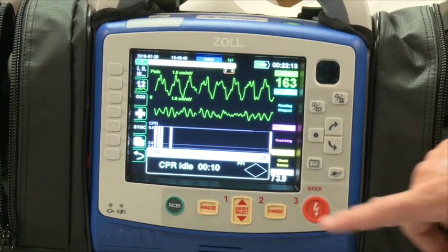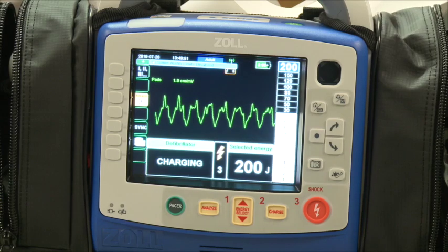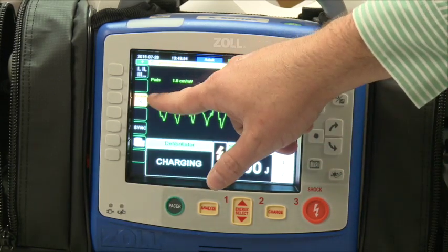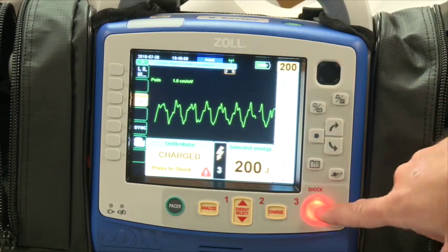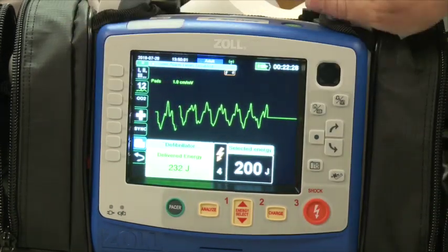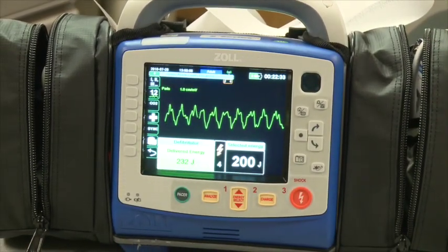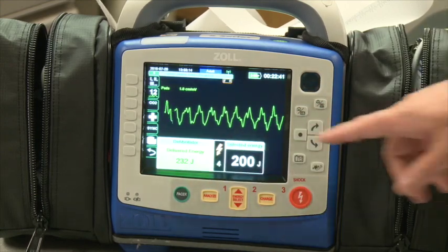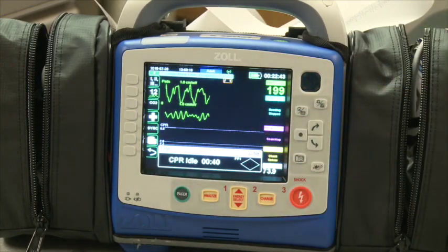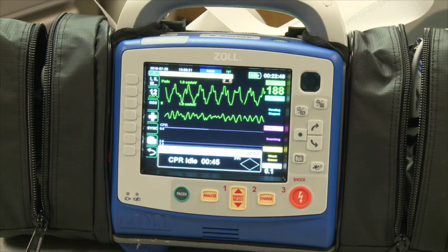If you charge to 200 joules, you have 30 seconds to deliver the shock. You can disarm or wait for the 30 seconds to elapse. Note that selected energy and delivered energy may differ — for example, selecting 200 joules may deliver 232 joules at the skin. The monitor and pads measure each patient's impedance individually, so it delivers exactly the right amount of energy to the heart. That's an intentional feature, not a problem with the battery.